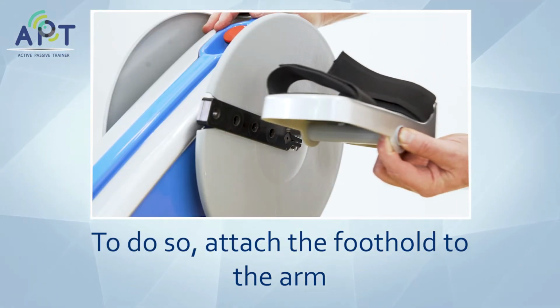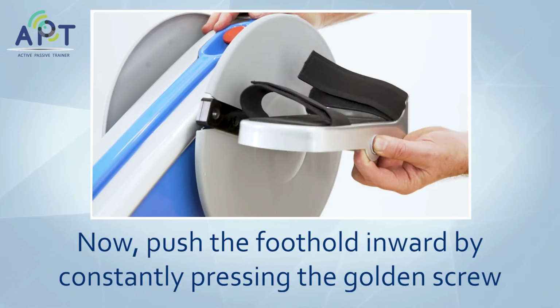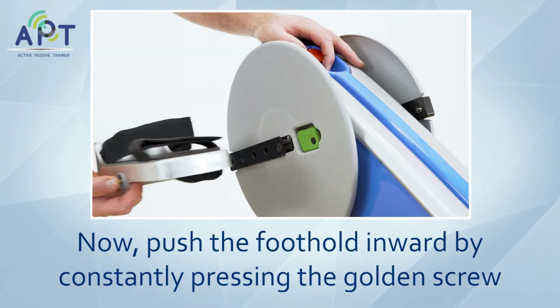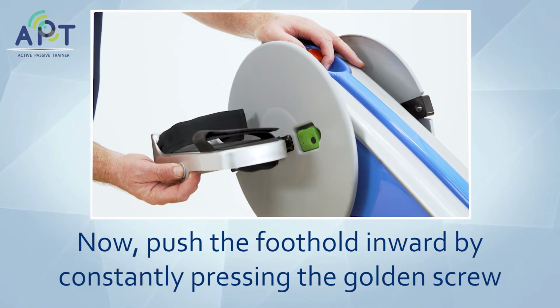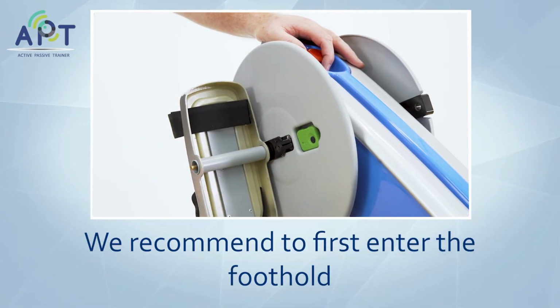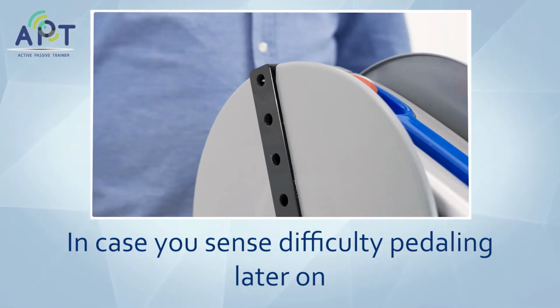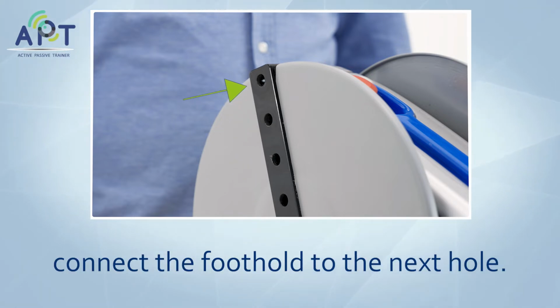To do so, attach the foothold to the arm while the golden screw is facing away from the A.P.T. Now, push the foothold inward by constantly pressing the golden screw until the foothold is caught at the base. We recommend to first enter the foothold into the closest hole from the turning axis of the A.P.T. In case you sense difficulty pedaling later on, connect the foothold to the next hole.